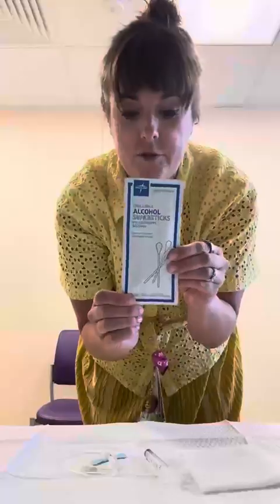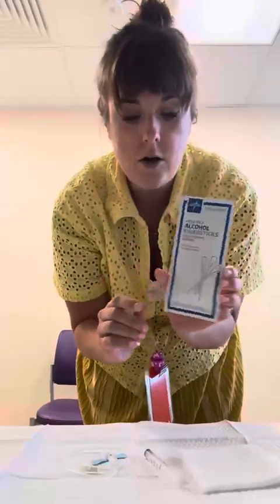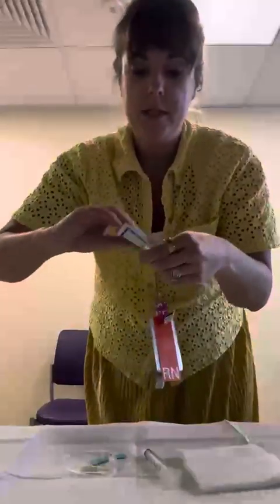So I've already put a lot of this stuff on my sterile field. I am going to use the alcohol swab sticks. This is the antiseptic of choice for our blood cultures. So we're prepping the skin with the swab sticks. Alcohol is the choice. It's quick drying, and the sticks just prevent you from having to touch the pad and then accidentally maybe touching the site. So swab sticks for the win.